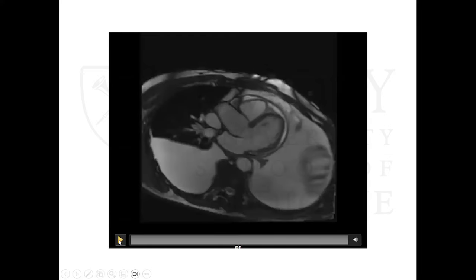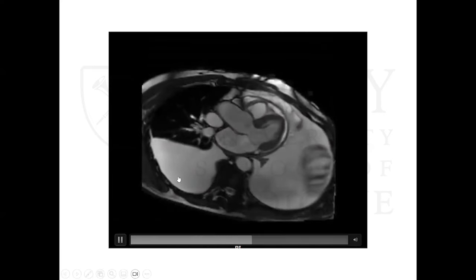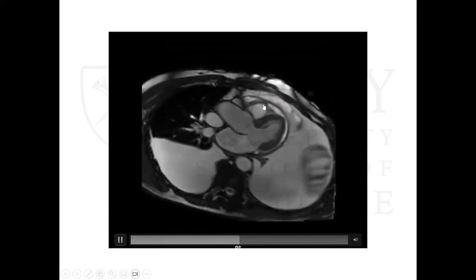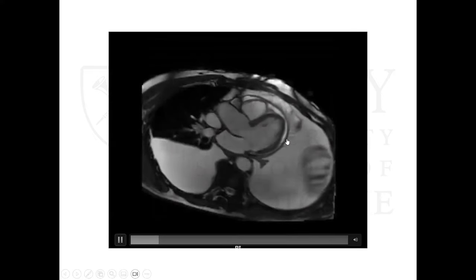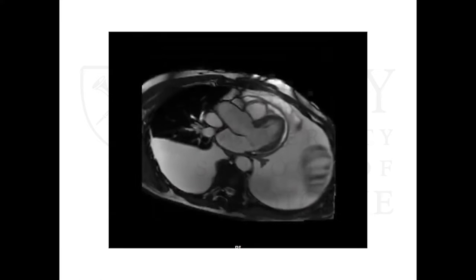And then this here is our three-chamber cine. I think here we get a good redemonstration of some of that. Obviously, we're still seeing more of those pleural effusions, but you can see some of that septal bounce that's ongoing. And then we can also see more of our pericardium here. You can still see some of that effusive process. We can see a relatively thickened pericardium wrapping all the way around. But that ventricular interdependence is redemonstrated here. And as we established earlier, that's a really important component of diagnosing constrictive pericarditis in our patients on cardiac MR.